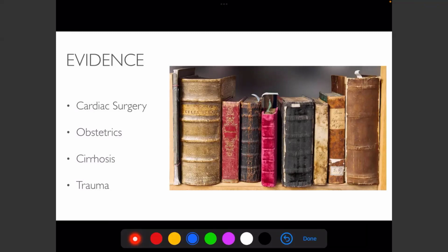I think, especially in the United States, it's limited. Outside of bleeding and hemorrhage, it's going to be a tough sell to say, I think that EXTEM is a better test than INR for cirrhotics, so we're just going to randomize people to EXTEM, and then they can all get LPs if their INR is like 6. It's a tough thing to get approval for. So there's going to be some limited data based on that, but the evidence is pretty good in different topics.